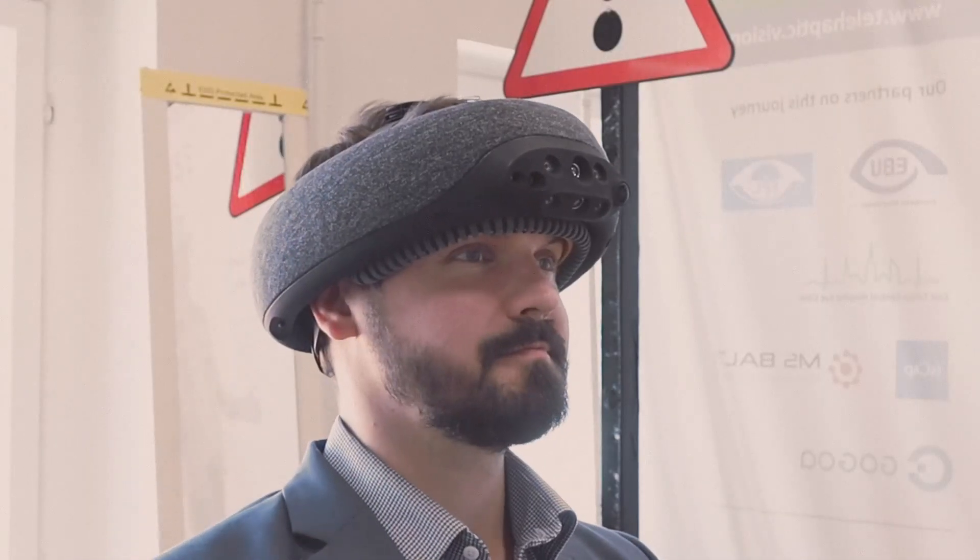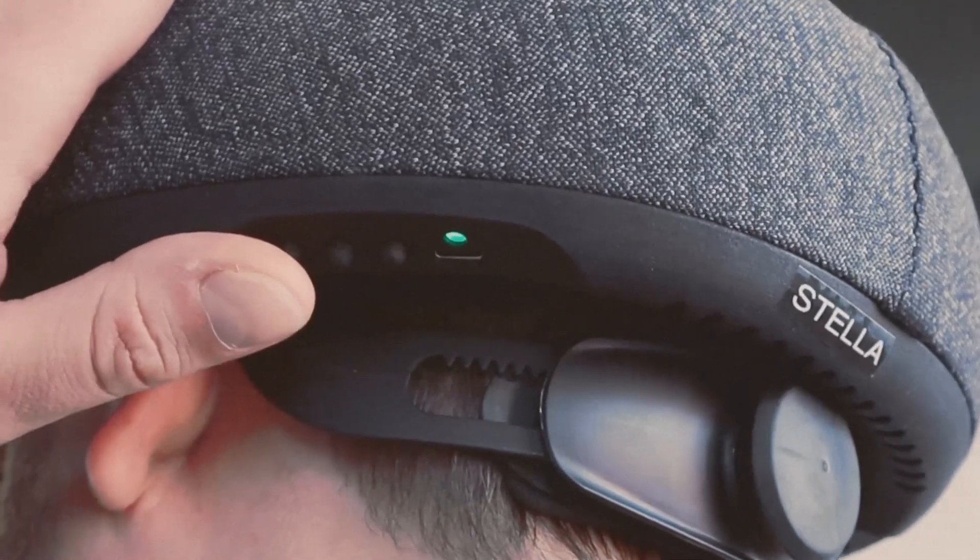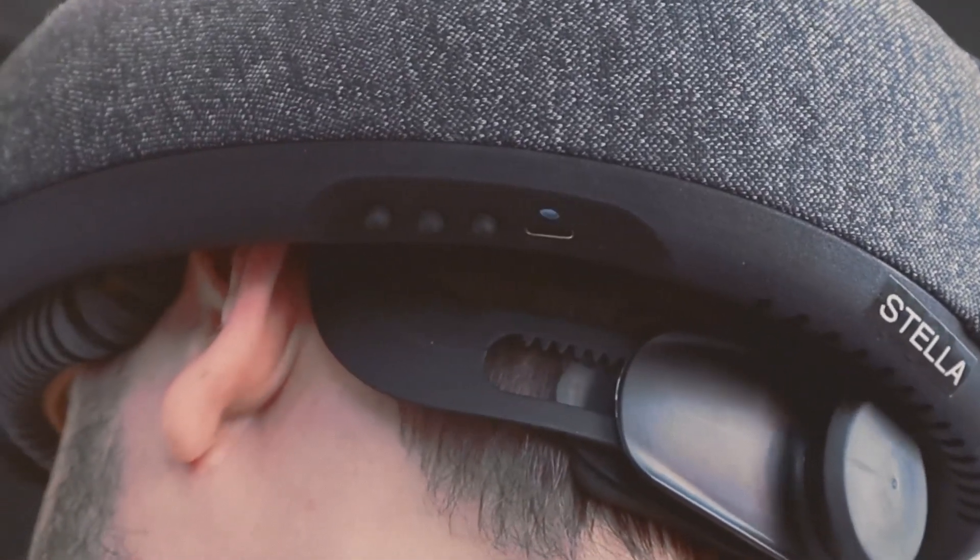Turn on the device by switching the power button. Wait until you hear the power-up sound and feel the welcome animation on your forehead. Click the rear button to activate the haptic mode and you are ready to start.